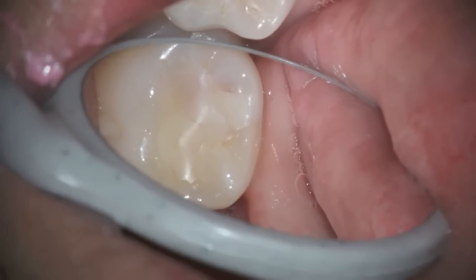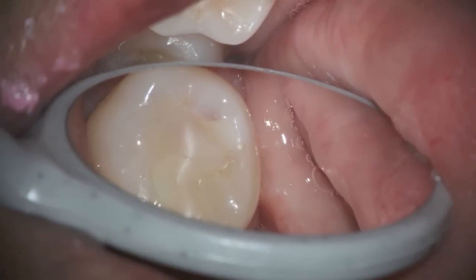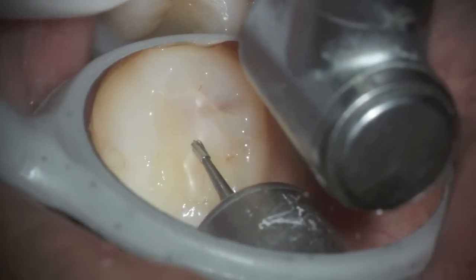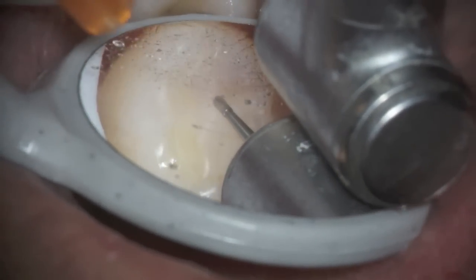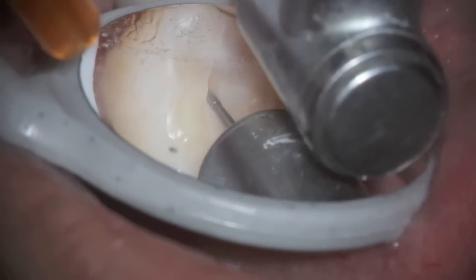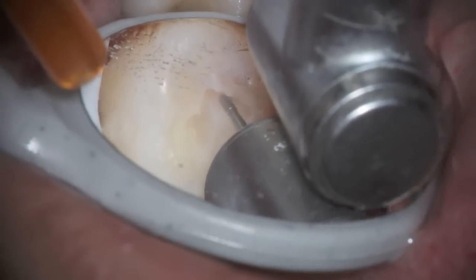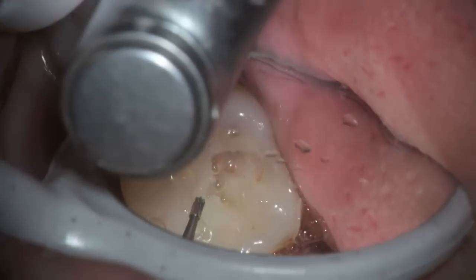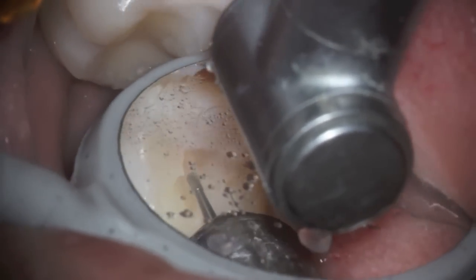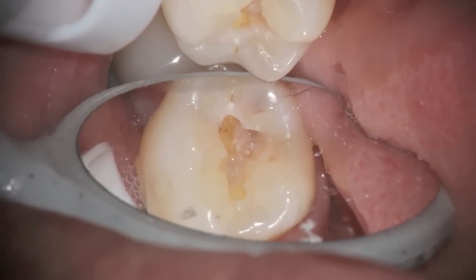This filling was done over another filling. The dentist who came in to do the work removed the tooth-colored filling but wasn't able to get all of it out, and then placed this filling over the tooth-colored one. That can happen when the tooth-colored filling is quite involved and looks the same color as the tooth. That gives a good reason why someone should put down a base or allow the tooth-colored filling material to be a different color — one that really has some contrast to it.